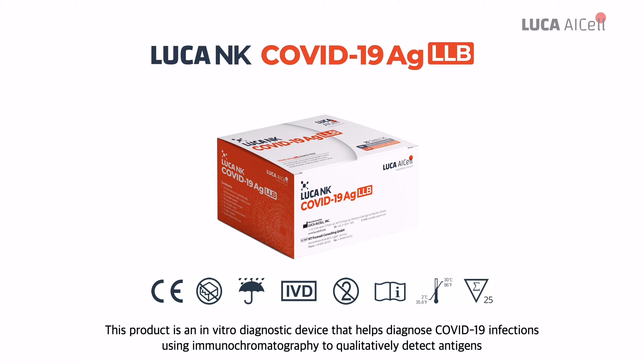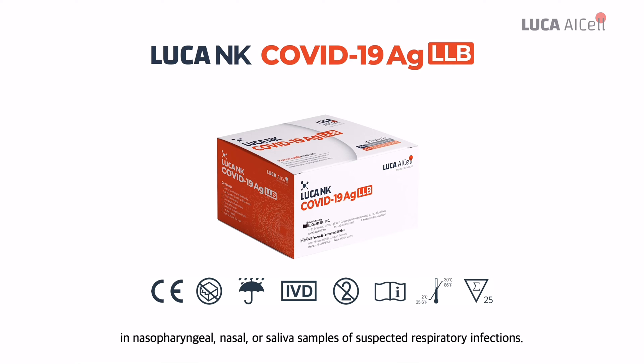This product is an in vitro diagnostic device that helps diagnose COVID-19 infections using immunochromatography to qualitatively detect antigens in nasopharyngeal, nasal, or saliva samples of suspected respiratory infections.